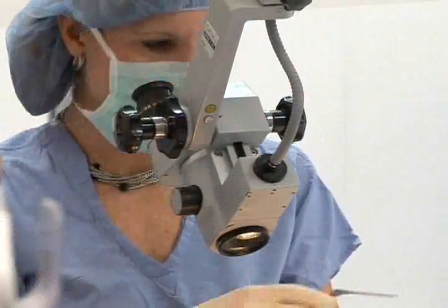These tubes are designed specifically to be placed in the eardrum such that they cannot fall behind the eardrum. They only fall out of the eardrum when they are no longer needed. The tube is then placed, and as you can see, there is a hole in the middle of the tube. All tubes have some kind of hole in the middle of them, and this is in order to aerate the space behind the eardrum to avoid reaccumulation of pus, mucus, or fluid.